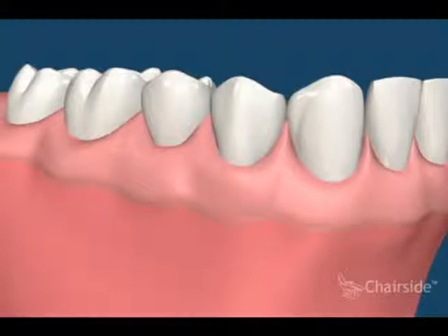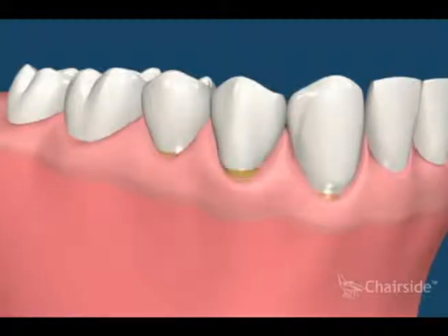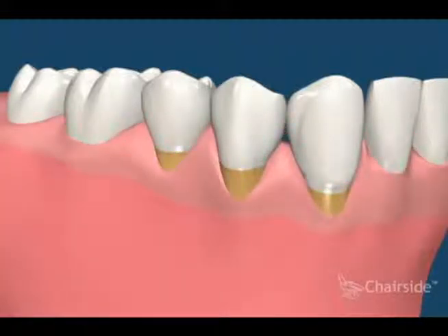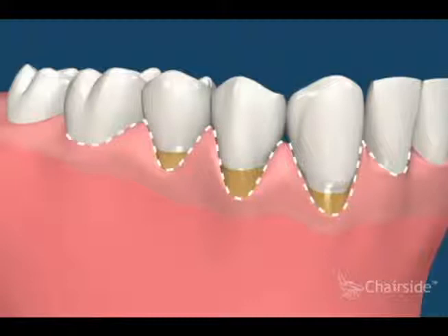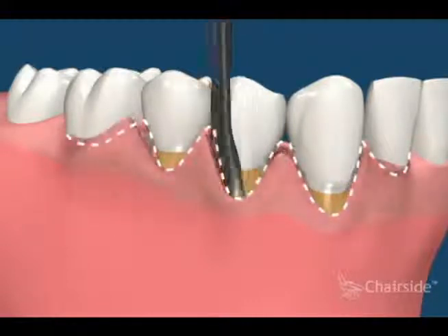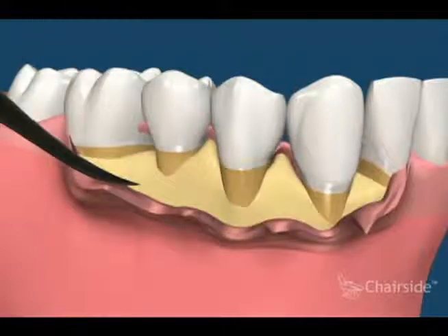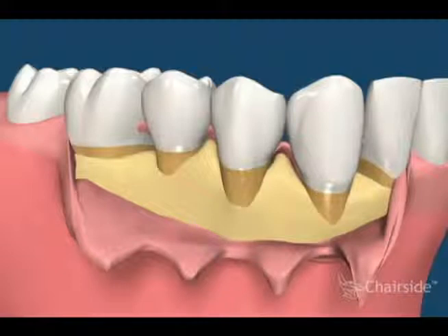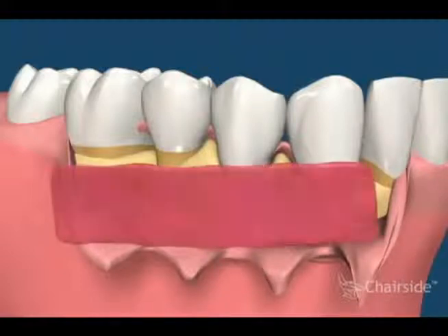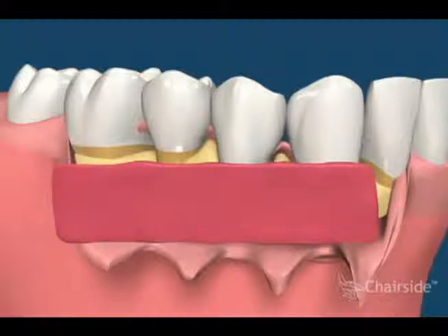Teeth may experience recession where the roots become exposed. This movie demonstrates a situation where some teeth have also lost their tough gum tissue or attached gingiva. Attached gingiva holds the gums firmly to the teeth and prevents calculus or tartar building up between gums and teeth. To treat this condition, the flap is reflected from the teeth. A prefabricated human graft tissue can be placed into the area.